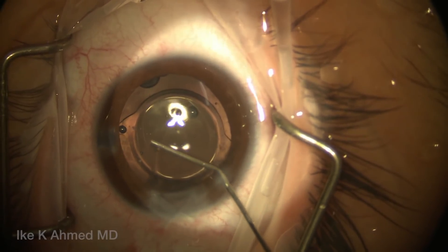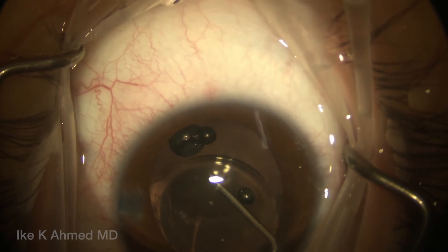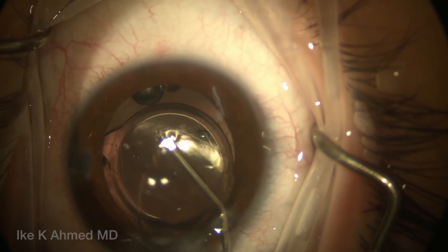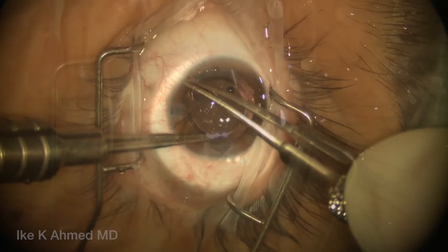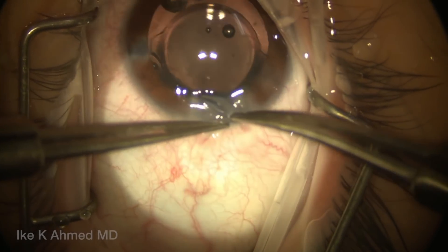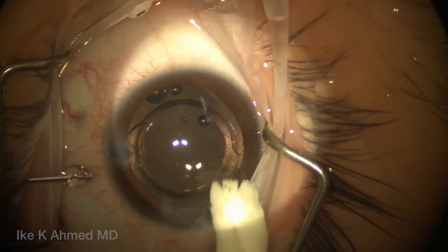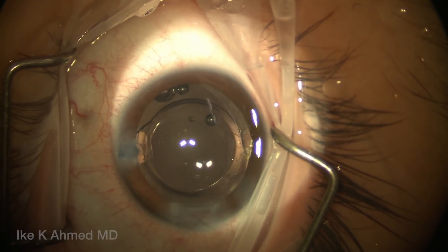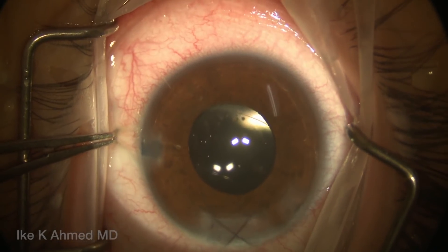Now we're going to perform posterior optic capture by pushing down on one pole of the optic away from the haptics, getting underneath the posterior capsule, and positioning the optic underneath. We see the cat's-eye appearance of the posterior capsule nicely fixating the lens in position, aligning it with the intended axis of implantation at approximately 85 degrees. This lens is nicely positioned — we prevent any rotation with that capture. What's key is to prevent secondary visual axis opacification, and we feel that avoiding anterior vitrectomy is a benefit, as there's no place for cells to grow along the posterior capsule or anterior hyaloid. This has been our preferred approach for pediatric cataracts and posterior polar lenticonus cases.